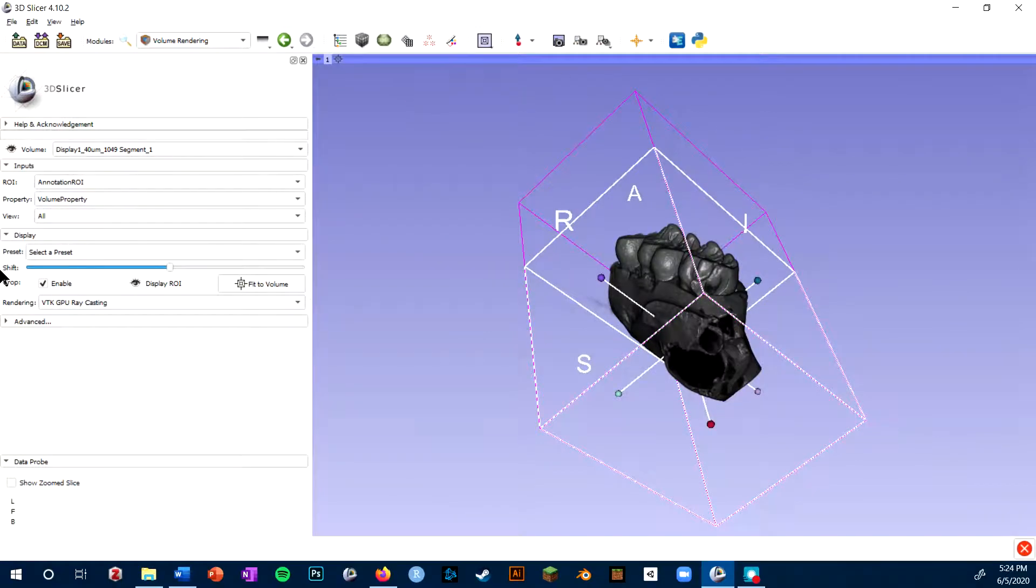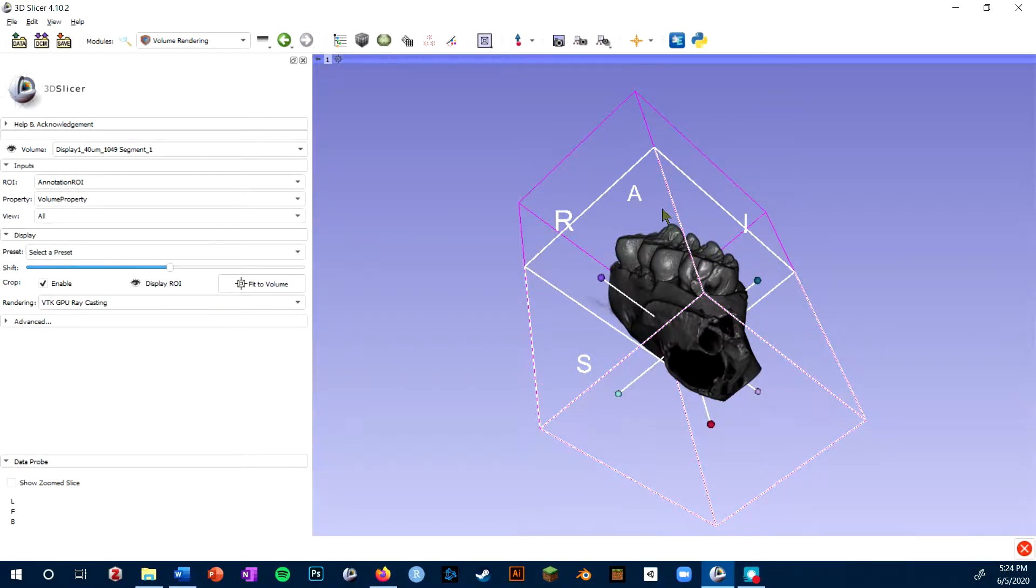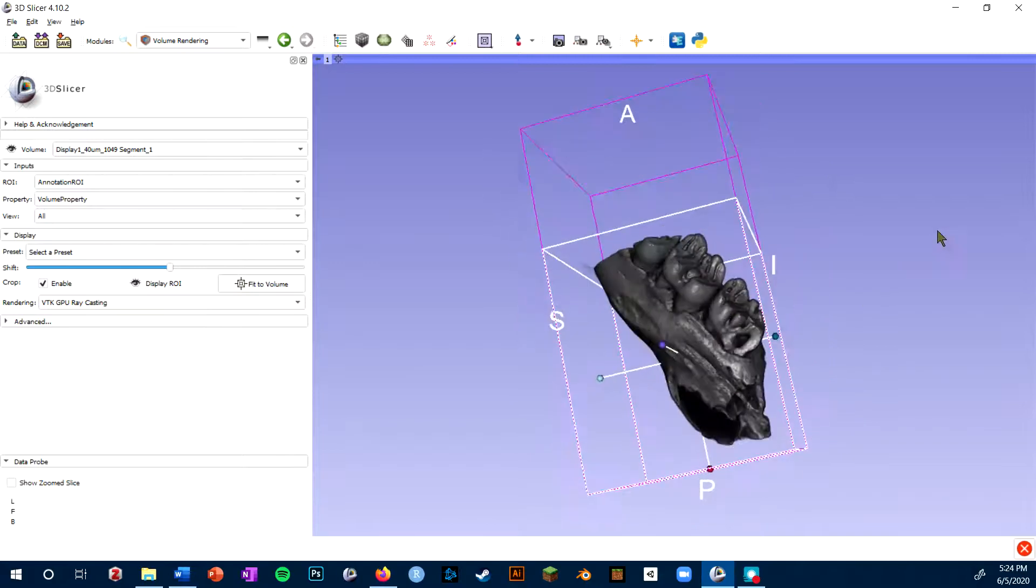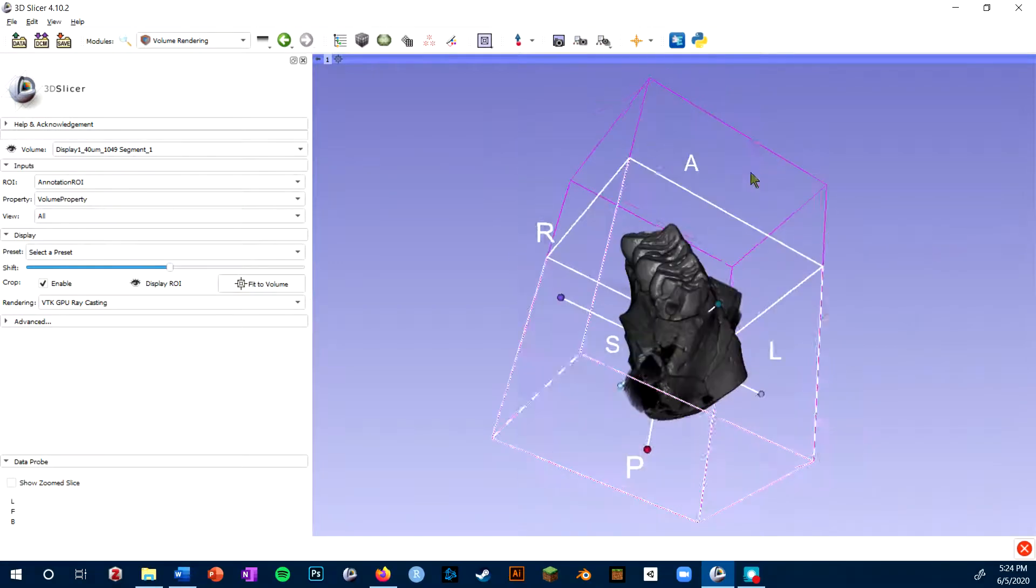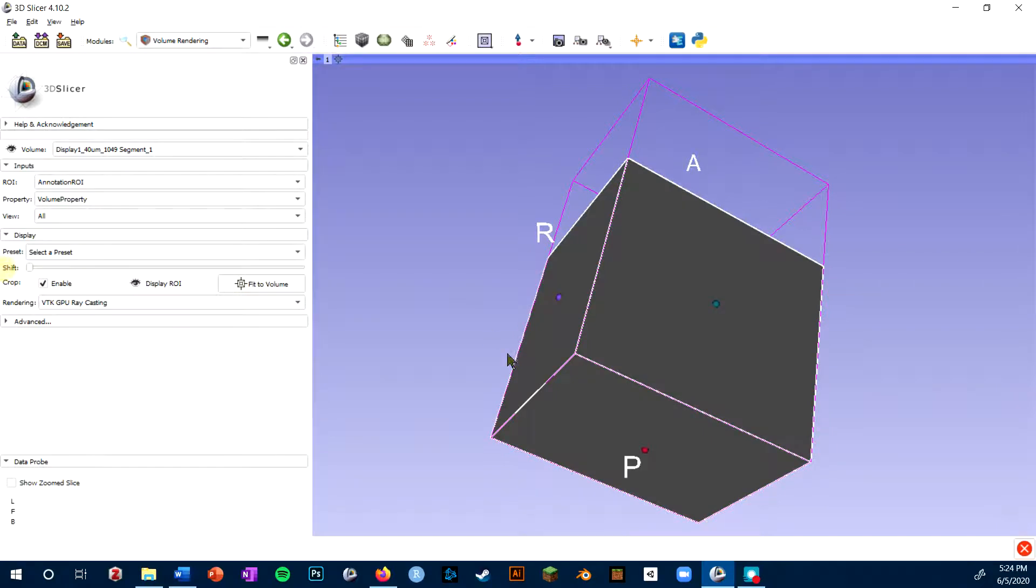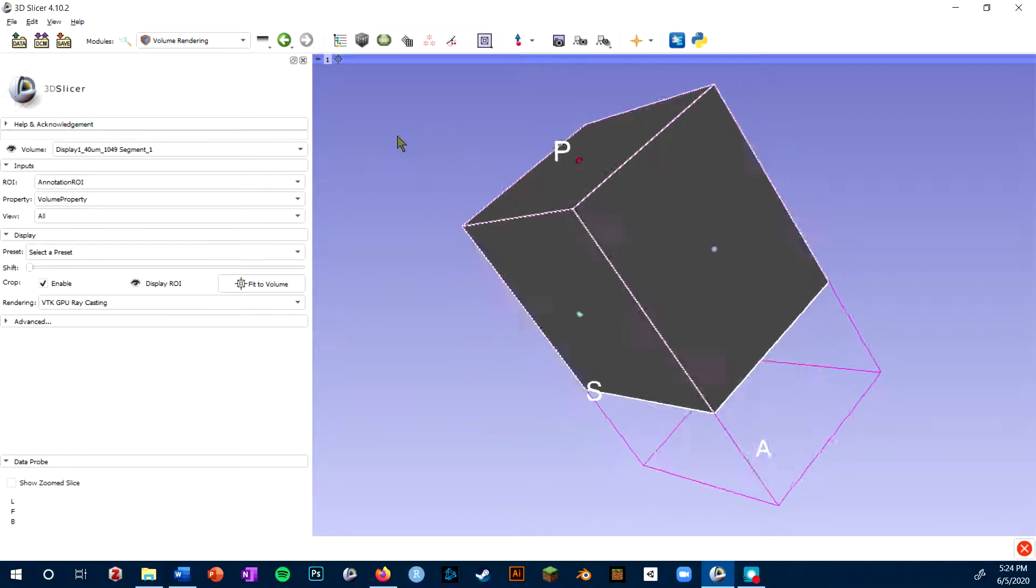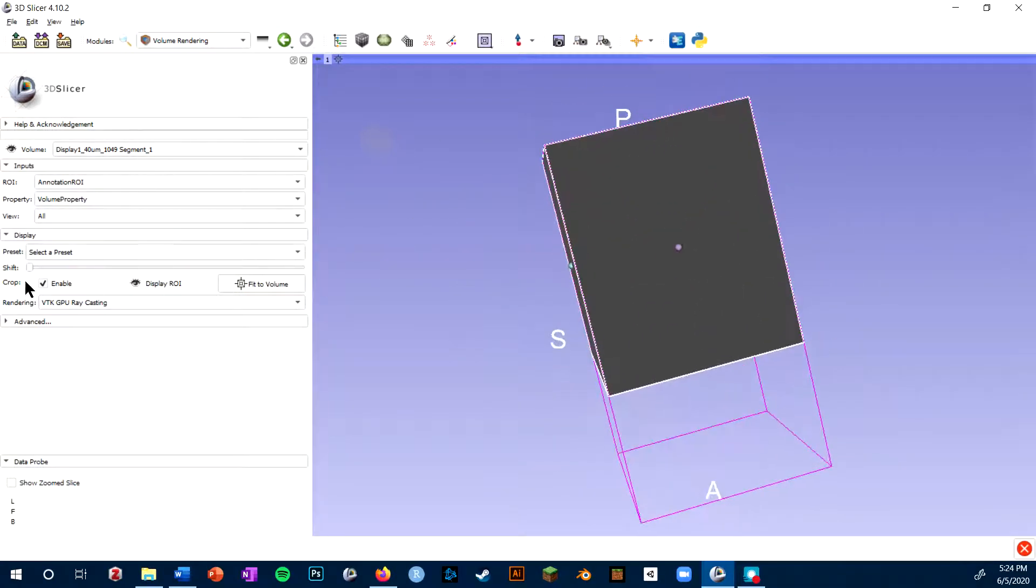The other thing you'll see is the shift function. This basically tells Slicer what the lowest density pixel voxels to render are. You'll see if I shift it all the way down, it's going to render the entire volume including the air.